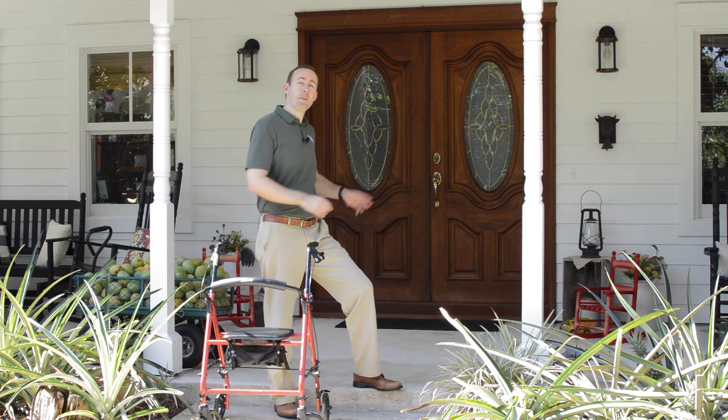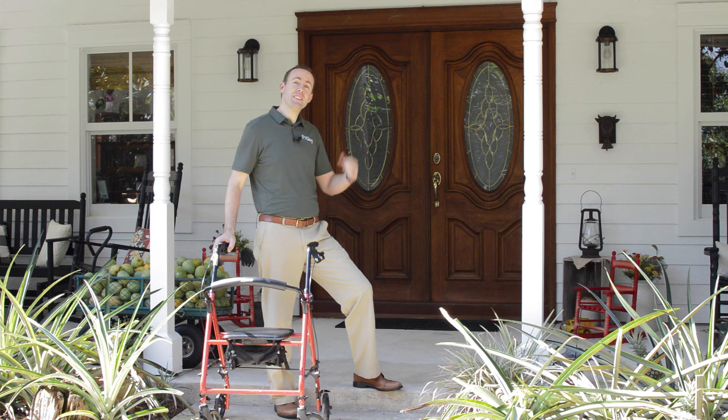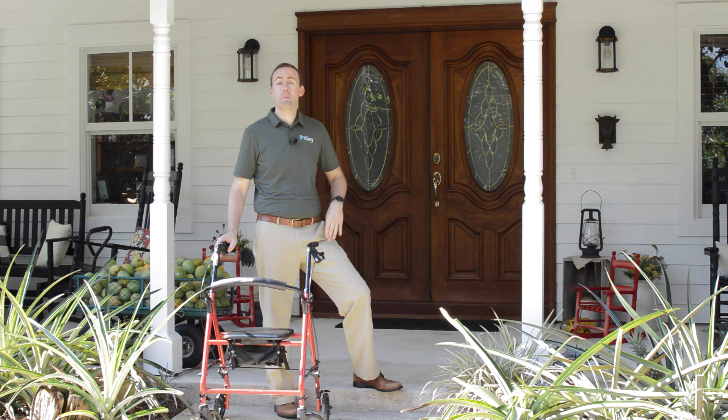Do you have a step in and out of your house? Are you using a rollator? How do you go up and down that step safely? In this video, I'm going to show you how you can get up and down that step safely using your rollator. I'm Dr. Sean, your PT guy, and our videos help you learn how to move better and stay independent so you can enjoy your life. Let's get started.